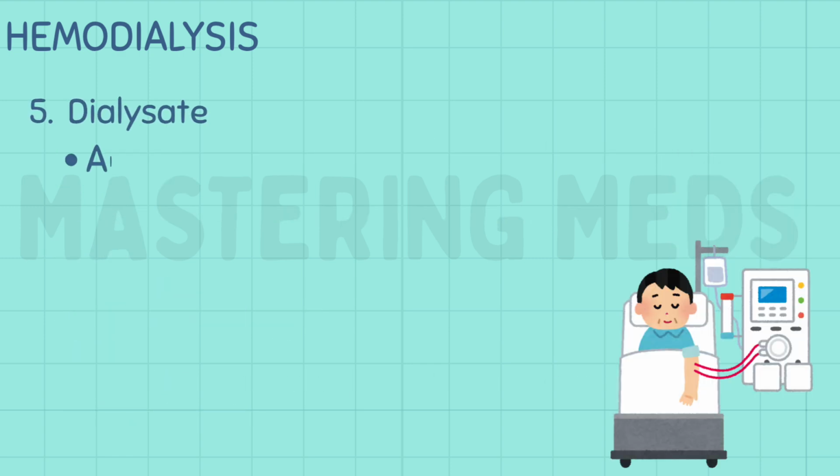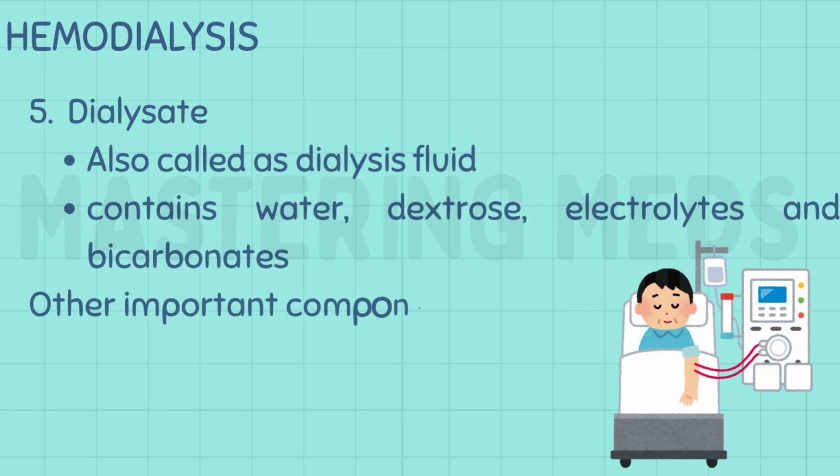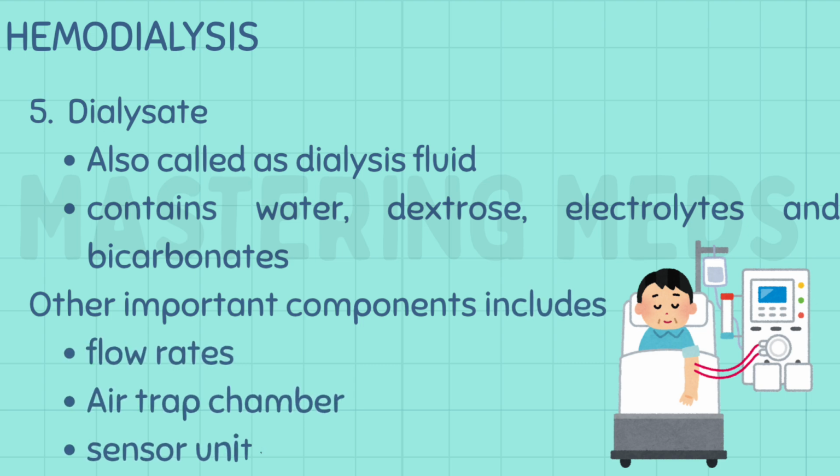The fifth component is dialysate, also called dialysis fluid, which contains water, dextrose, electrolytes and bicarbonates. Other important components include flow rates, air trap chamber, and sensor units.